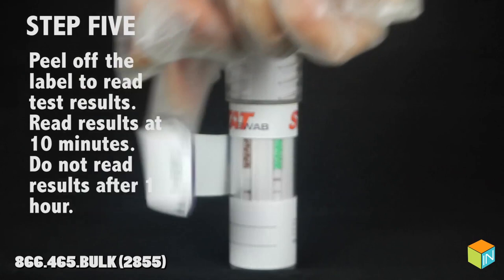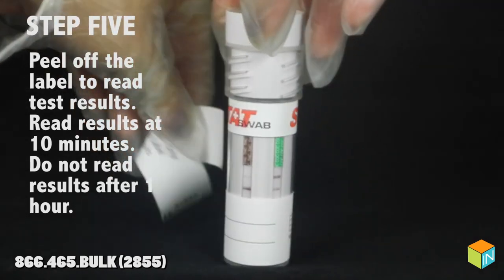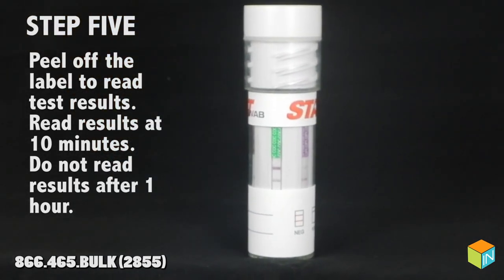Step 5: peel off the label to read the test results. Read results at 10 minutes. Do not read results after 1 hour.